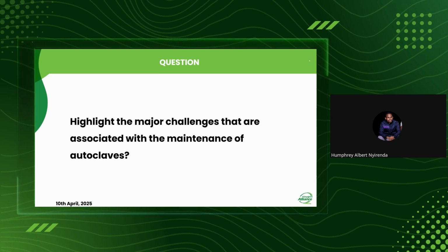But in instances where the control system is faulty or experiencing some flaws, that might be caused by maybe power fluctuations or shortings, the program goes haywire, and the pressure increases.